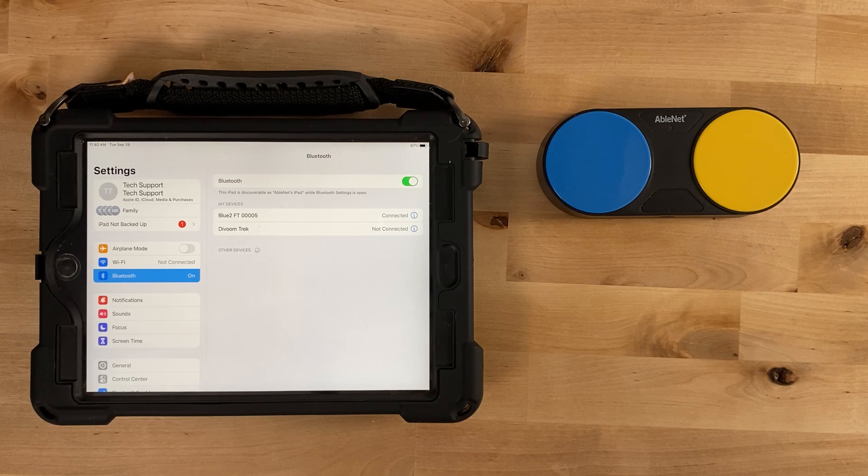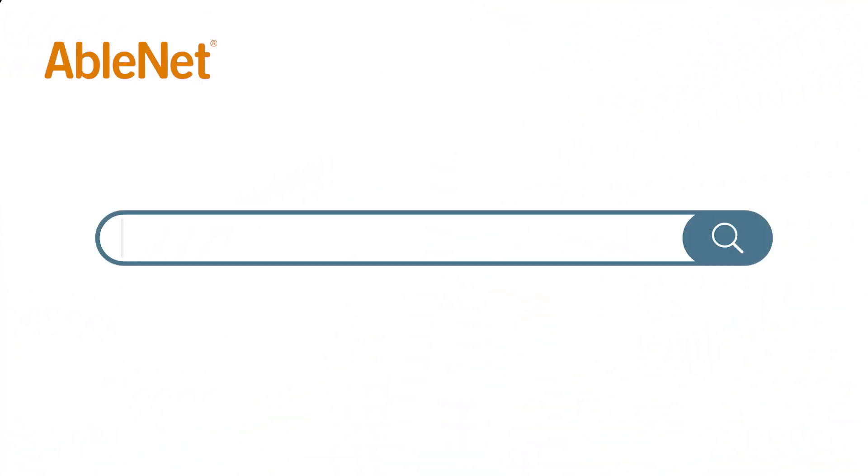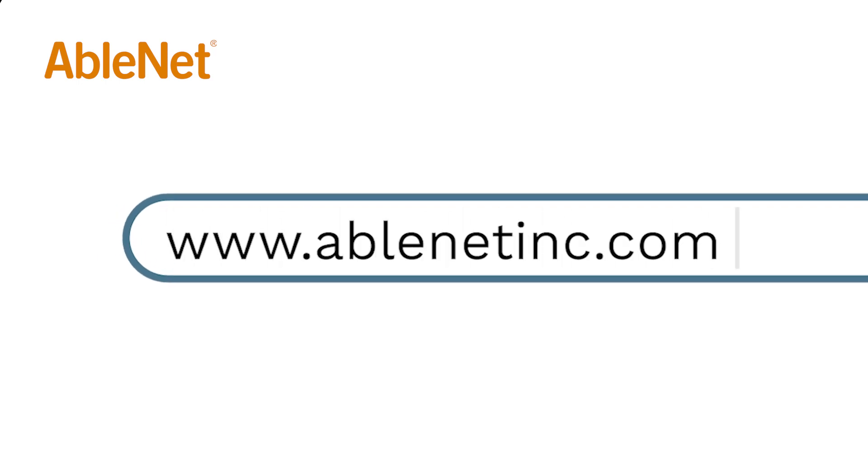Continuously activating either switch top will continuously send the same keyboard command to your device unless your switch control software is configured to behave differently. Your Bluetooth is now ready to use. For more great resources and ideas on how to use your AbleNet technology, go to www.ablenetinc.com and click on the help link at the top of the page to access our knowledge base.